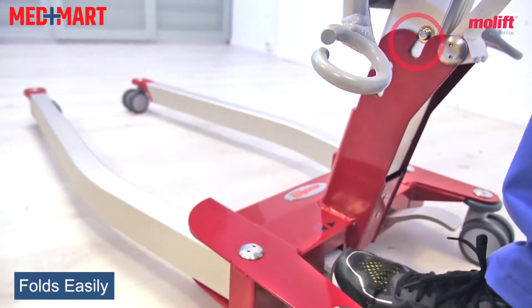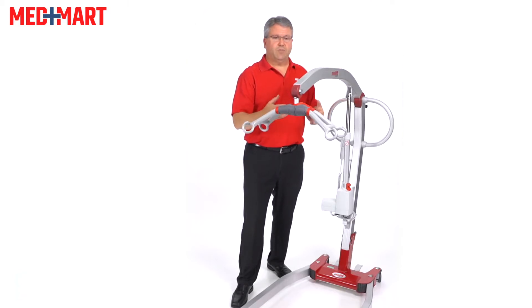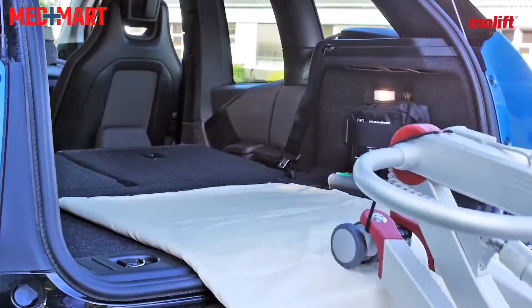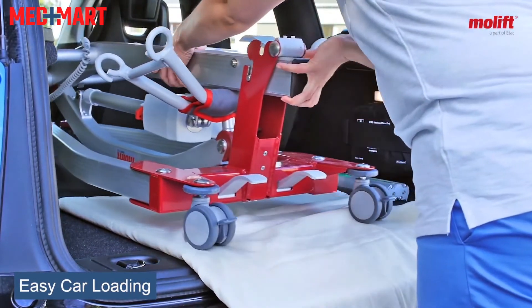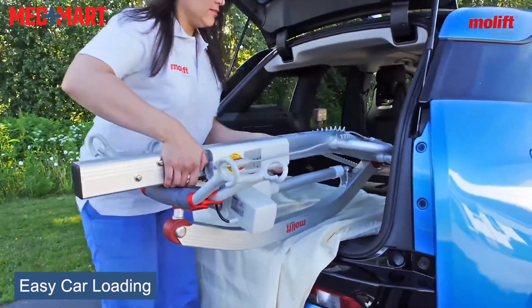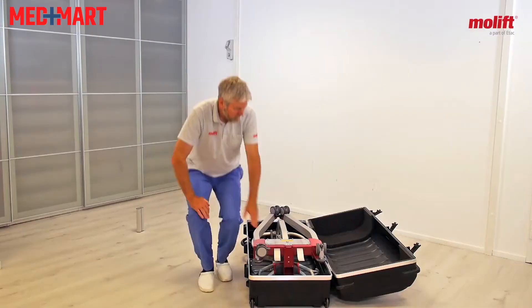What makes that nice is if you do have to travel and put this in your car — when you fold it up, it comes into almost a triangle type position and you can slide it in the back of your car. Or you can take it apart into two equally weighted pieces, which also makes it easy to put in your car and travel with.